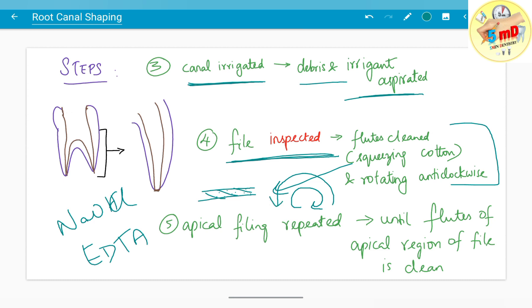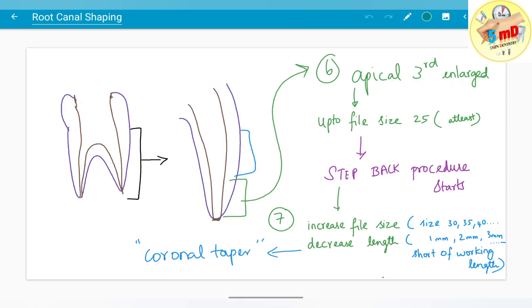Apical filing is repeated till the working length until binding is present, achieving a snug fit. Continue until the flutes of the apical region are clean and debris are removed. The apical third is enlarged up to file size 25 at least, after which step back is started.